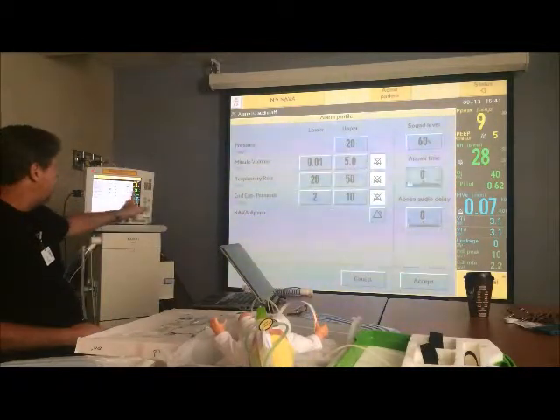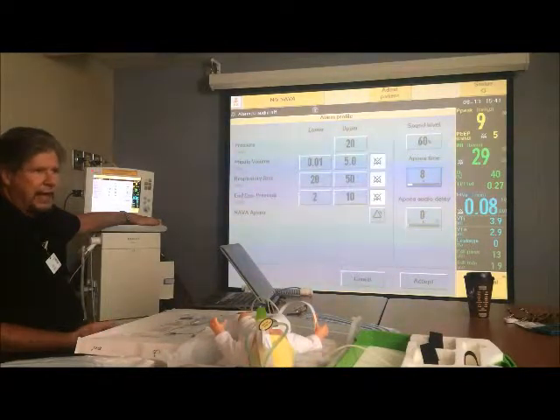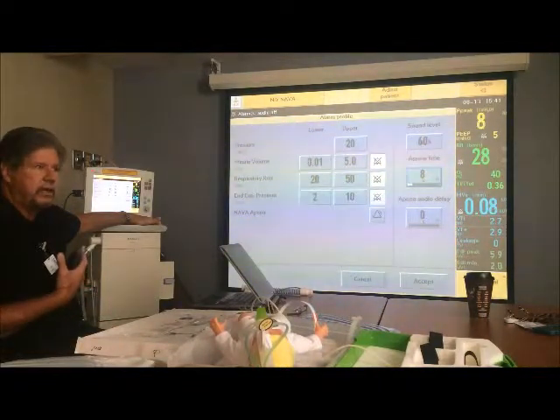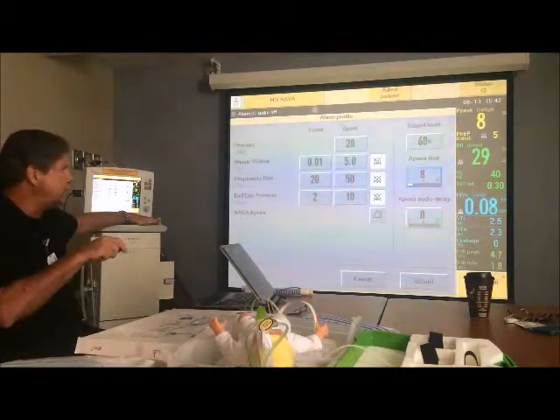But now, the nurse comes back to you a little while later and says, you know, this kid has these periodic breathings and goes to backup like 8 times every half hour. It's driving me crazy because every time he does it, the ventilator alarms, right? Is there something you can do about that? I said, well, no, we want the ventilator to go to backup, right? So I'm going to leave this alone.